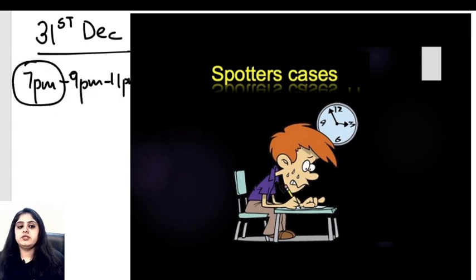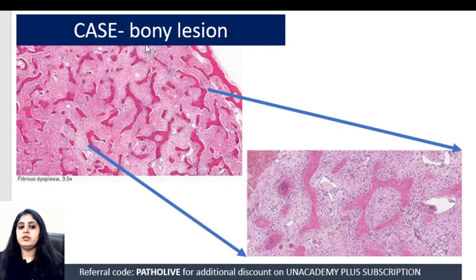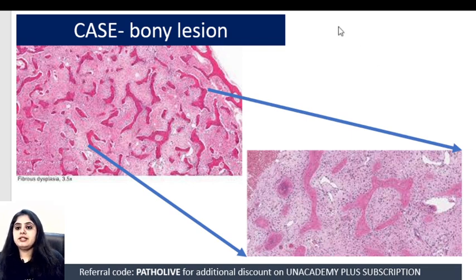Beginning with the first one of the day, which happens to be a bony lesion. I've shown you the lower magnification and the higher magnification of the same. When discussing a bony lesion, I have to concentrate on the bony trabeculae. For those who got it right — amazing — this is a case of fibrous dysplasia.